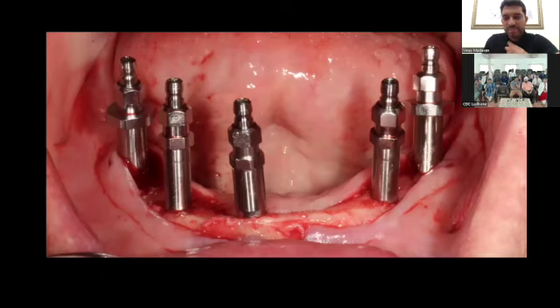So it's very streamlined, as you see. I don't have the implant planning in these slides, but typically when you do an implant planning, you want to verify again and see, okay, did I perform my treatment based on how my implant planning was done? And that's a good learning experience. And most of the time, like I said, these guides are not 100% accurate, but at least they'll put you in the ballpark. That way you don't end up with a lot of complications that we discussed last time.